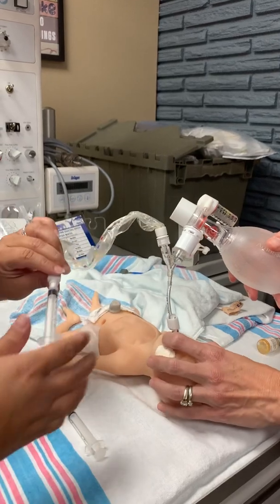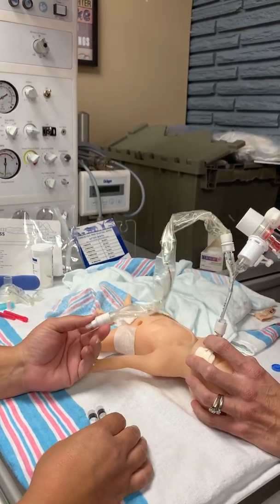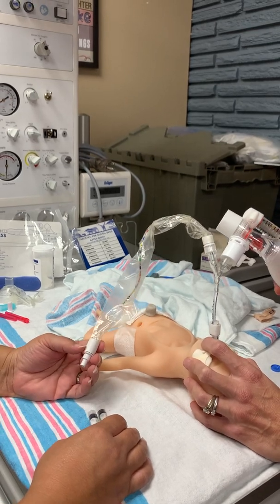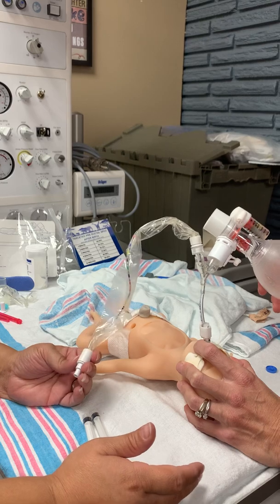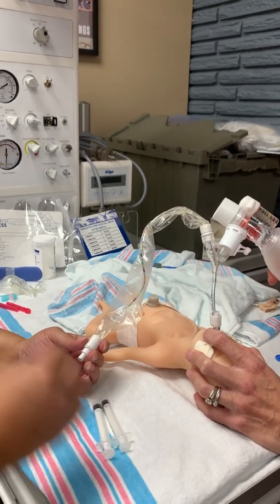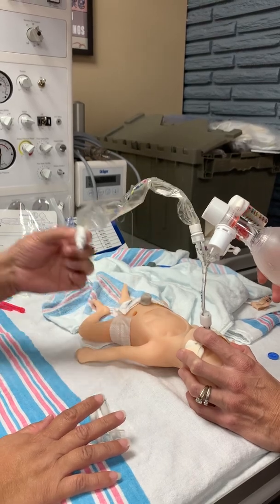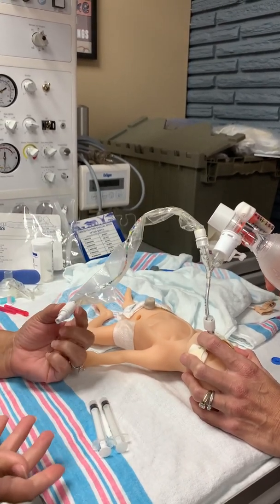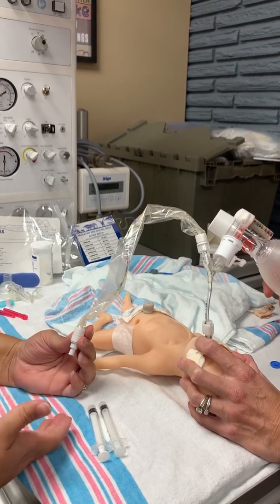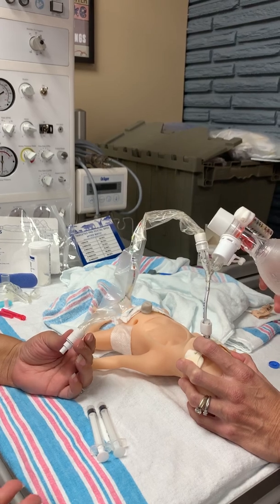Now, suction, we should try to not suction for at least 1 to 2 hours per manufacturer recommendations. But in an emergency, if you feel that the patient is deteriorating and the tube may be clogged, of course, suction if needed. A good tip is I usually actually leave this in and put a red cap on here just to try to remind other staff members that we shouldn't be suctioning for at least the next hour or two.